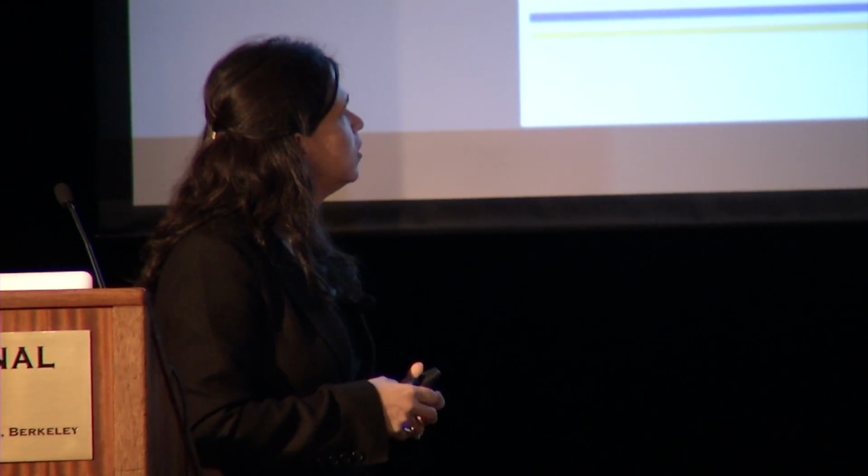Well, it turns out that this simple measurement, blood oximetry, is a very noisy measurement, and that's why the electronics is so complicated. And why is it noisy? It's because you only have 2 little point sources of light and 1 photodiode. You are measuring the transmission of light through the tissue and through your blood. Then you pick up a very tiny AC signal that is on top of a huge DC signal, which is AC because we are measuring the pulsating blood.